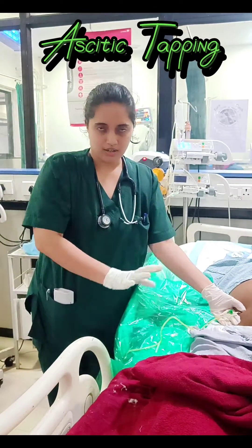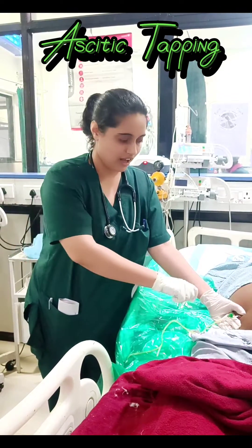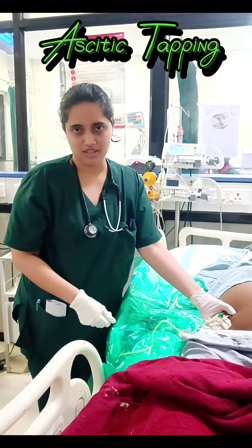The site of the area is mostly the lower part. Never prick near the dilated veins that you see in this area.